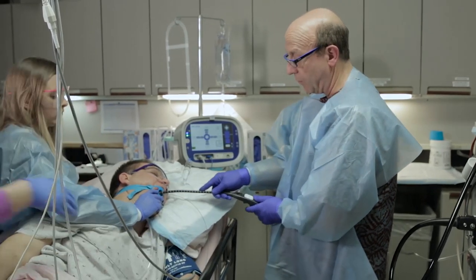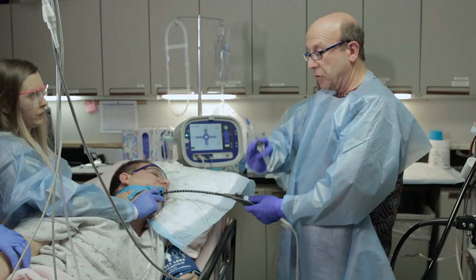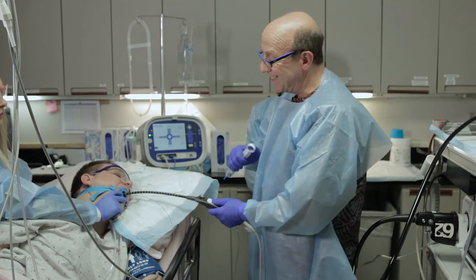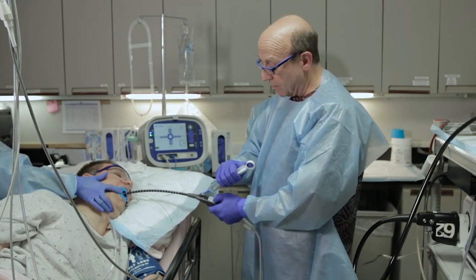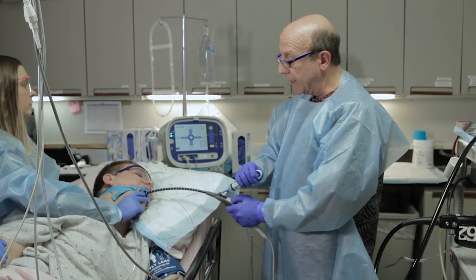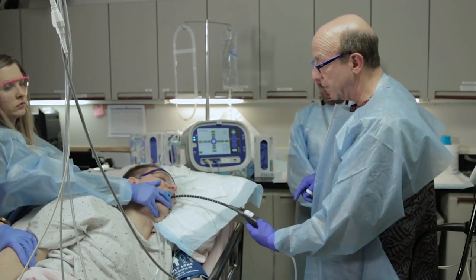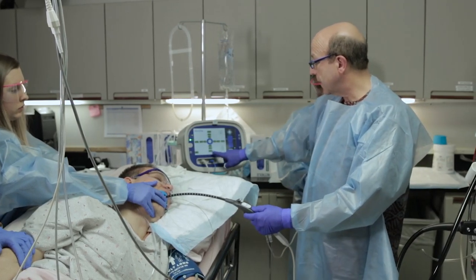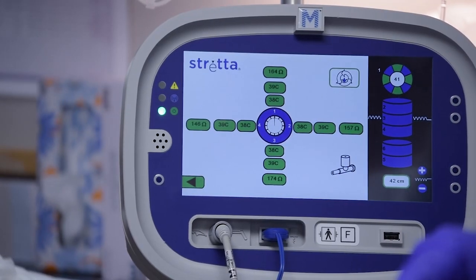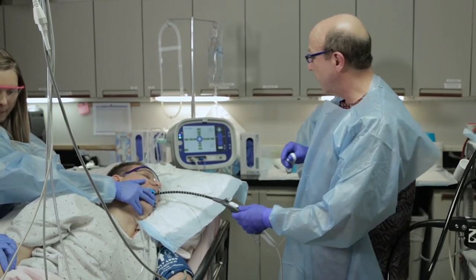We'll pass the catheter down so that it is one centimeter above the actual measured z-line, which is where we'll begin our first treatment. There are four levels of esophageal treatments, so since the z-line is at 42 centimeters, we'll begin at 41 centimeters. We're using a syringe with a blue valve that doesn't allow the balloon to over-distend the lumen or wall of the esophagus, preventing any risk of perforation. We inflate to a count of about five to eight so it just barely touches the wall, then extend the needles using the slider.